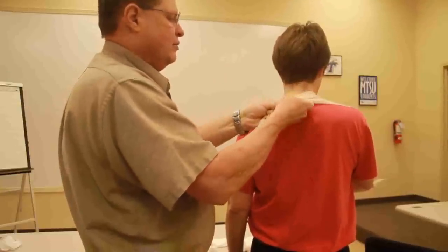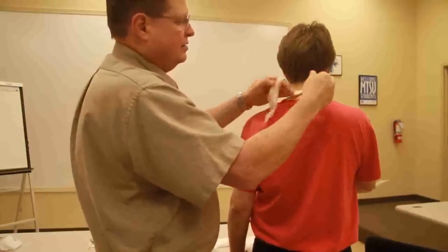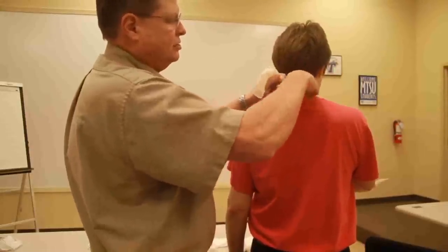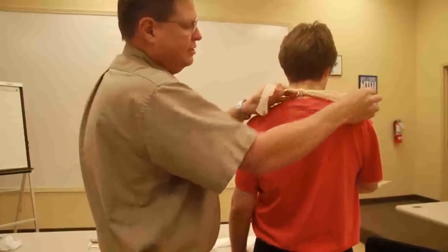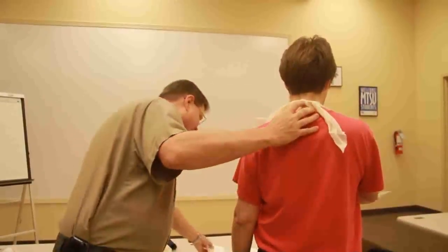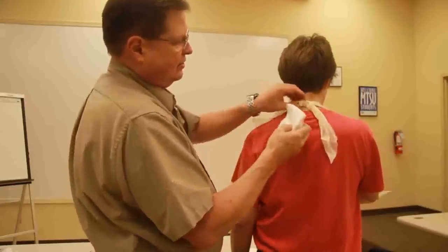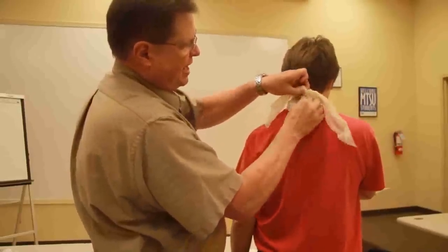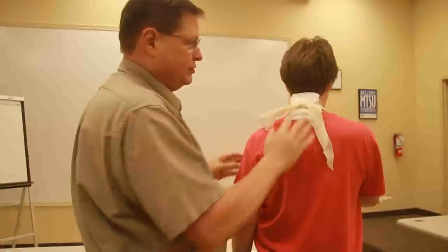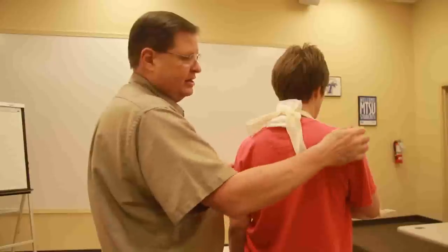Now we're going to tie a square knot in the triangular bandage here. Anytime that a knot hits the skin, we want to make sure that we pad it because there are a lot of nerves and vessels running down in here in the spine. So we want to make sure that we pad that with some padding, with some four-by-fours or whatever. The reason we use a square knot is they're easier to get undone and they hold tightly.